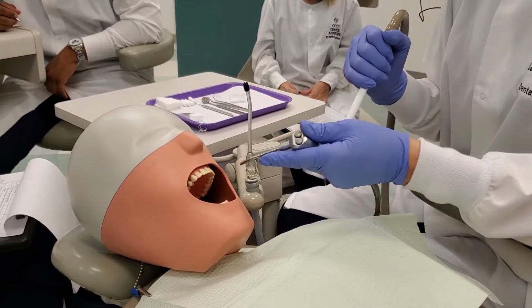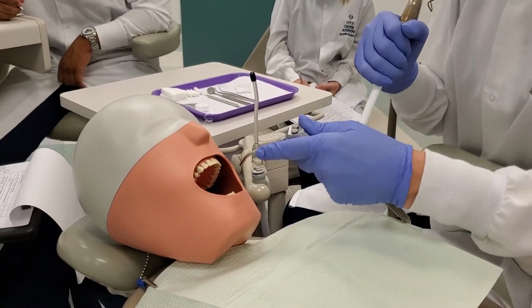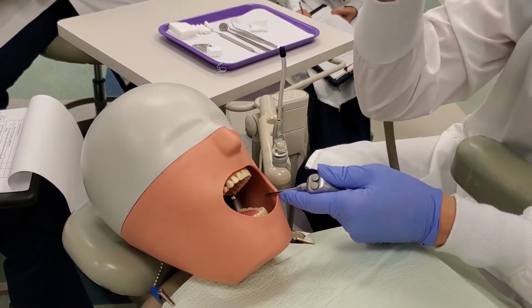So the first thing we're going to do is a lower tooth. So I'll have you do tooth number 19. I want to see where you're going to be placing the HVE. If I give you number 19, you need to pull, retract, come on in, palm thumb grasp.